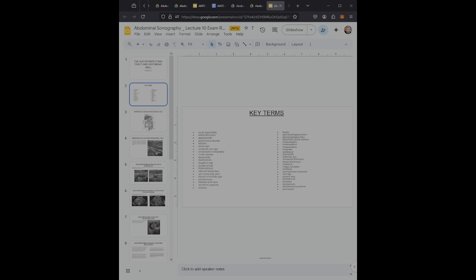So there are a few key terms, for example, acute appendicitis, inflammation of the appendix, bezoars, the masses of various ingested material that may cause an intestinal obstruction. The cinnamon bun sign is a sonographic sign associated with the appearance of intussusception. Crohn's disease, an autoimmune disease characterized by periods of inflammation in the GIT. The donut sign is a sonographic sign associated with pyloric stenosis.